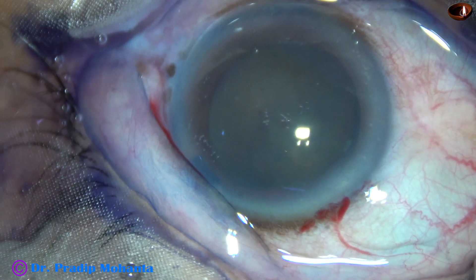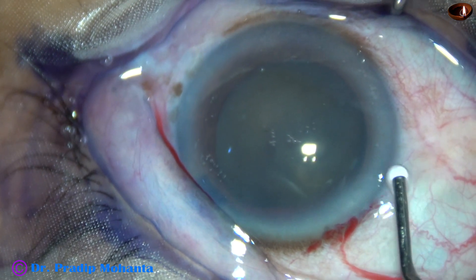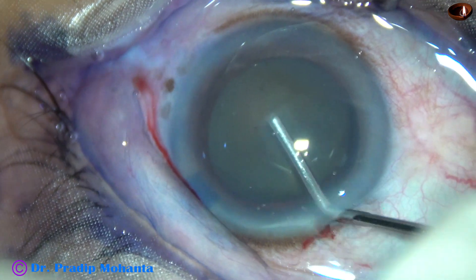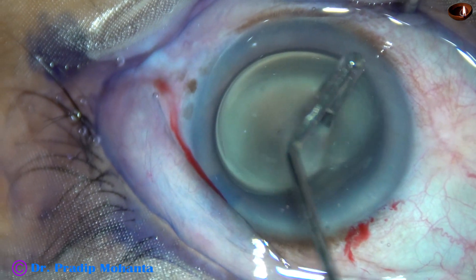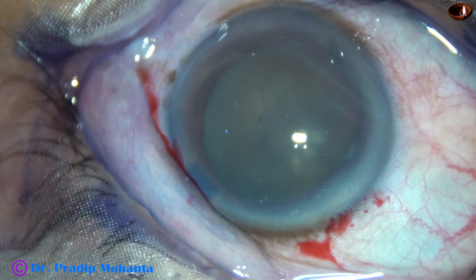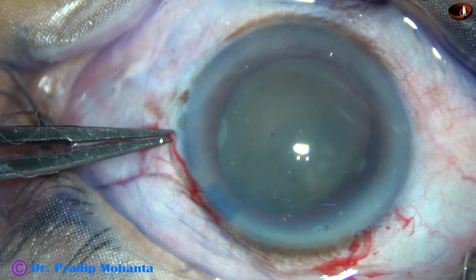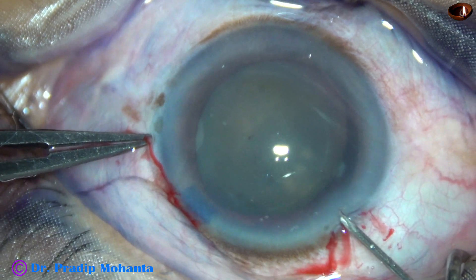By this time the incisions have been made and the anterior capsule has been stained with trypan blue dye. Now I am going to try capsulorhexis. I am going to take a 26-gauge bent disposable needle. So I will make a puncture on the anterior capsule and raise a tag.